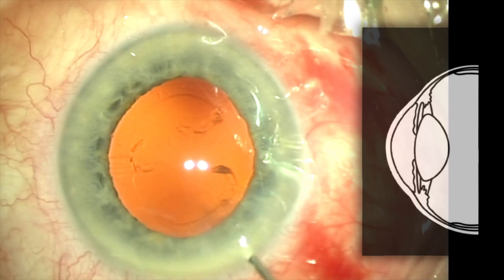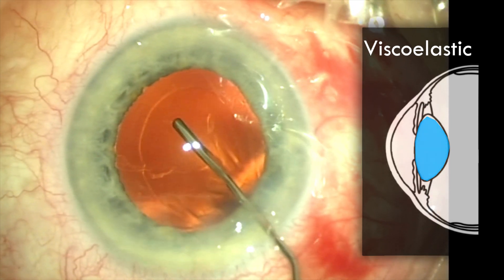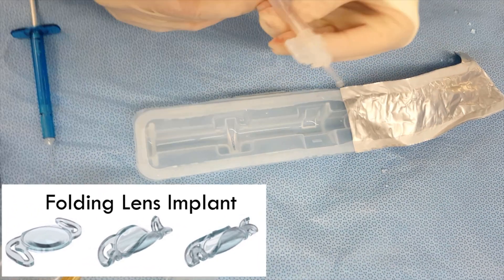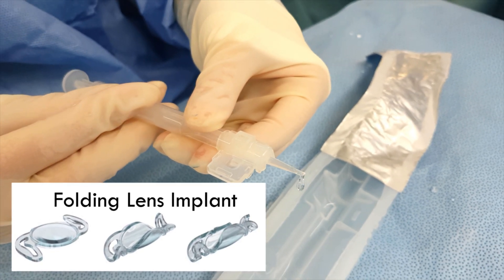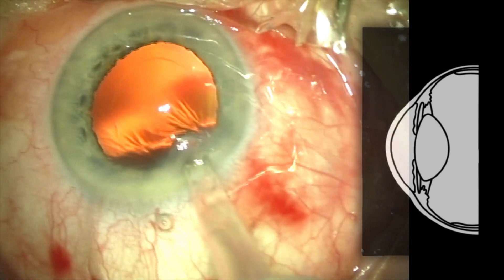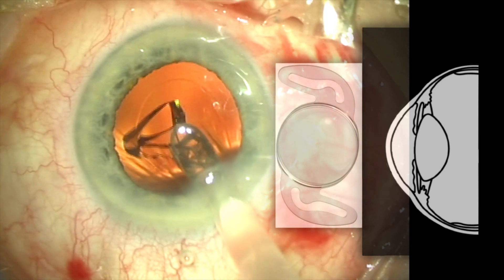I'm now using more viscoelastic, but this time I'm putting it into the capsular bag to create a nicely inflated space to allow me to insert the intraocular lens. This is the acrylic intraocular lens implant — it's already folded and prepared in an injector ready for insertion. As I insert it into the capsular bag, I'm trying to facilitate it unfolding in the correct place by making sure both the haptics — which are the arms of the lens — are gently guided into the correct position.